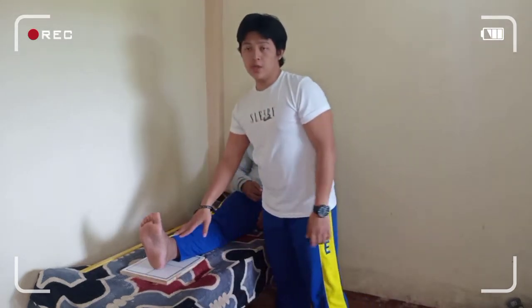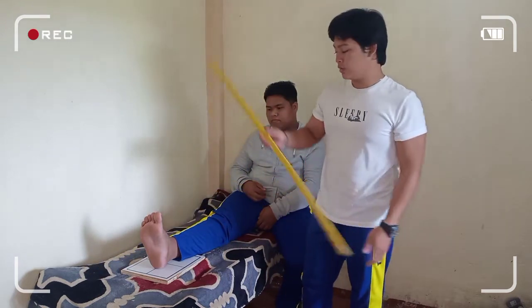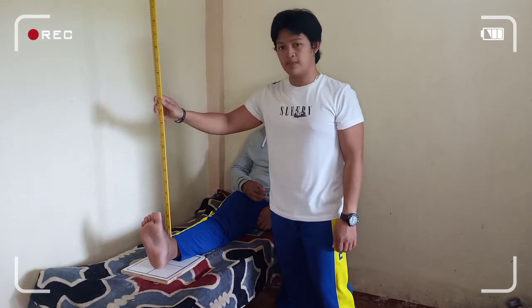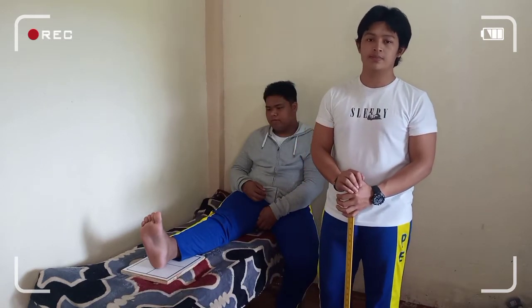This is the true AP projection of the ankle. The central ray must be perpendicularly directed to the ankle joint. The structure shown in this projection is the distal end of the tibia and fibula.